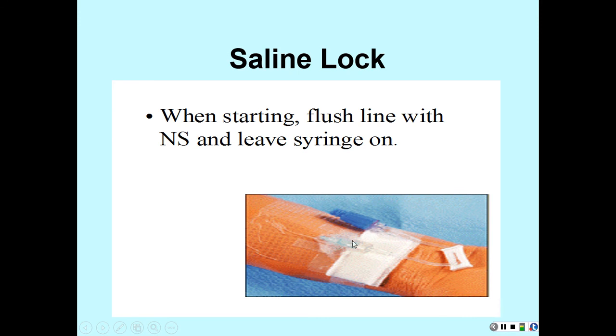Okay, remember we talked about how you can get phlebitis and vein irritation. The more you're manipulating your IV catheter, if you're having to put your syringe right down here, you're manipulating it, irritating the vein. So use that if you can. It just makes life easier.